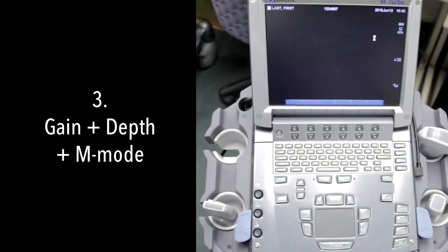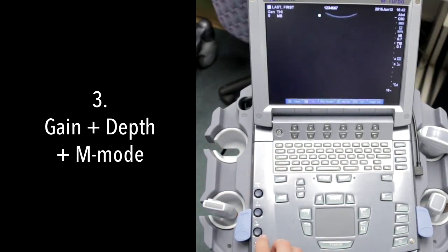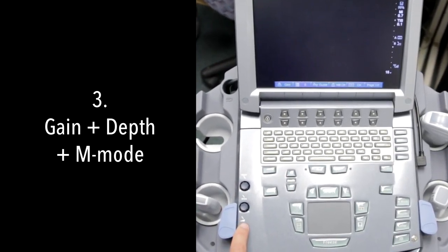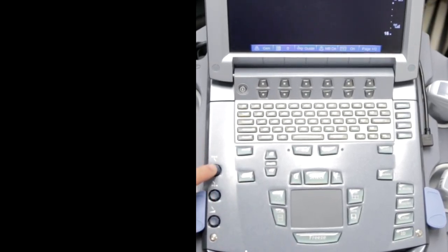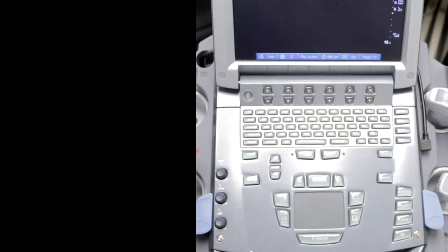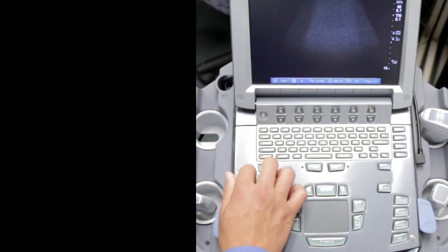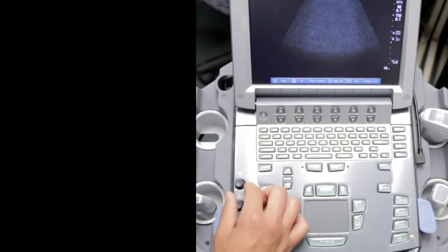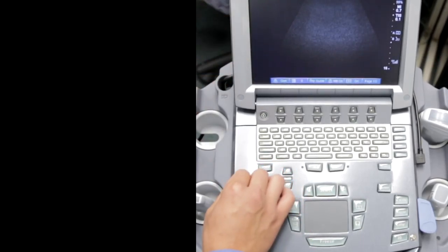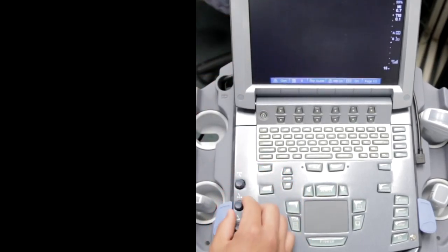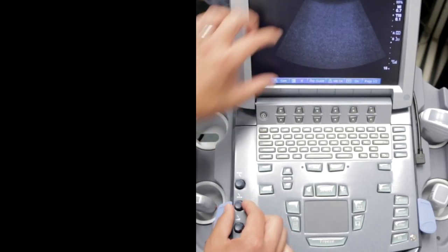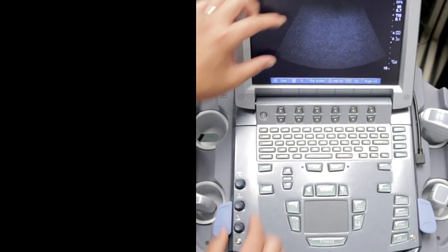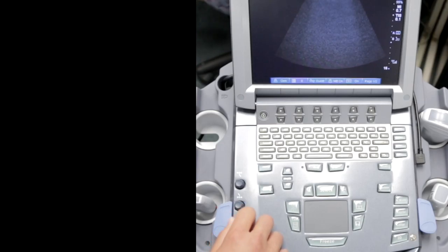When you're scanning with the mTurbo, here's your gain. When you push it, these little knobs pop out. Here is your near field gain, that's your top half of the screen. Here is your far field gain, that's the bottom half of the screen. And this is your overall gain, your total gain.